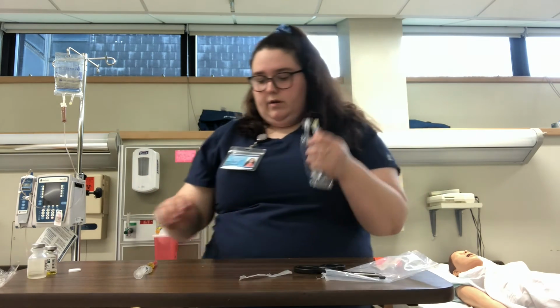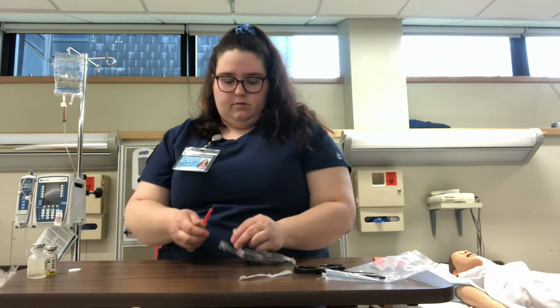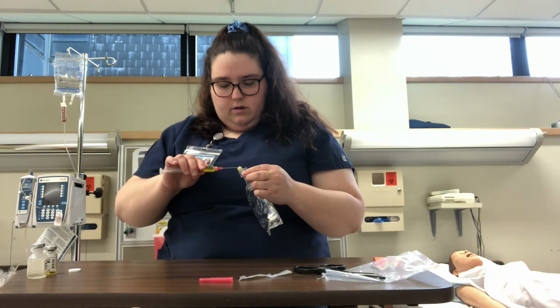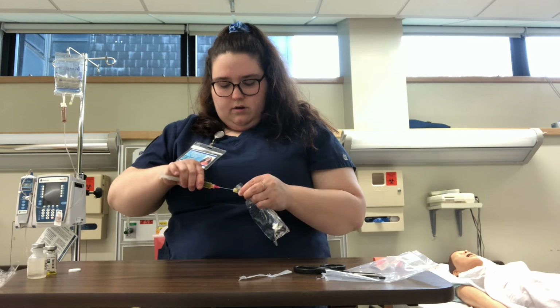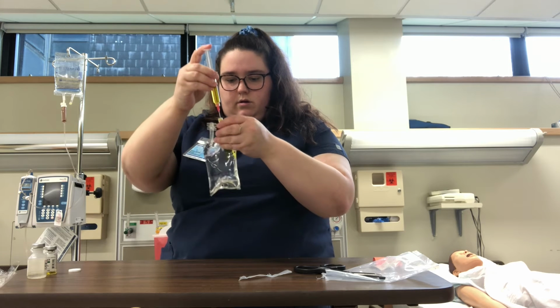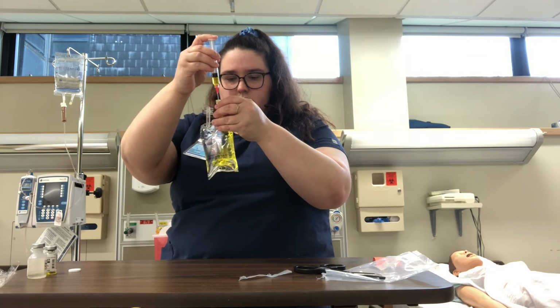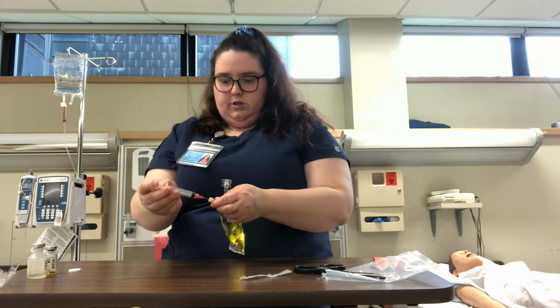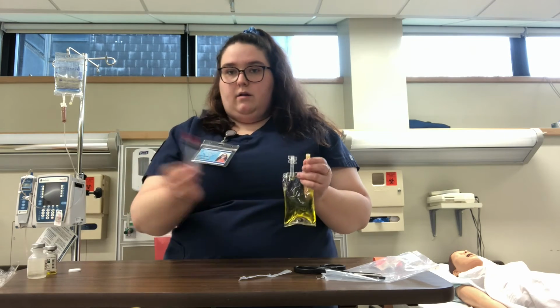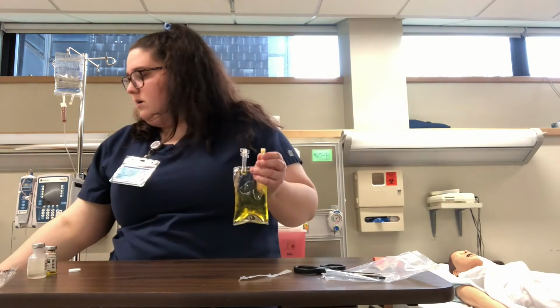and since it came out of the bag, I don't need to clean this. I'm going to check that in there, cap my needle, and throw it in the sharps.